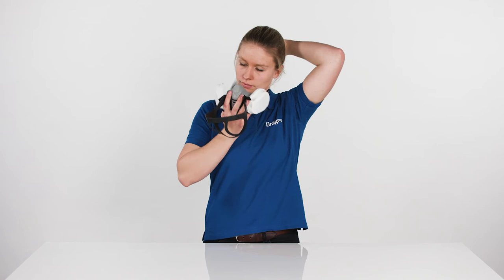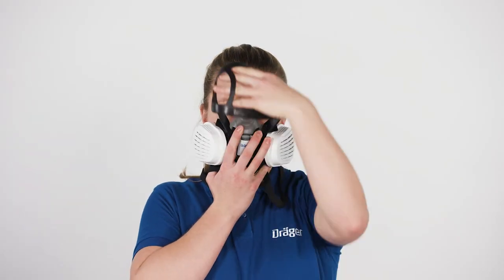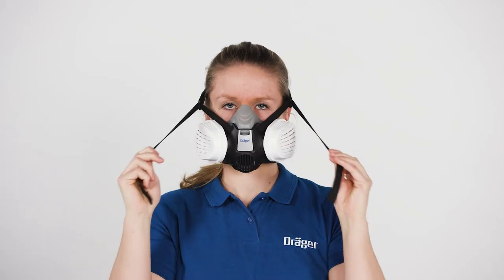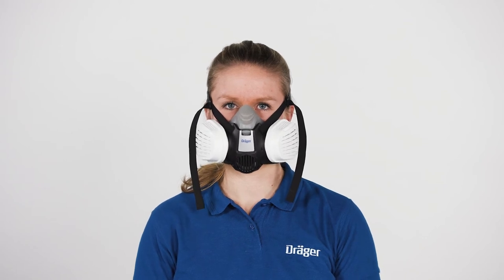Put the neck strap around your neck. Position the half-mask over mouth and nose and place the head harness over the back of your head, with the head harness above your ears. Pull the ends of the top straps until the half-mask rests tightly against your face. If necessary, adjust the harness again until the half-mask rests against your face tightly and comfortably.